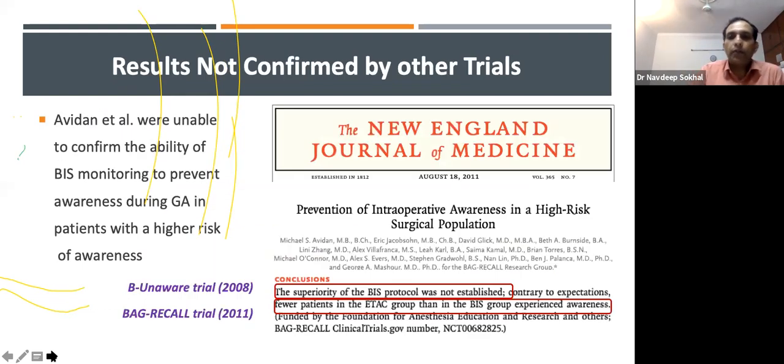But then there was another trial published in 2008, the B-Unaware, and the BAG-RECALL trial in 2011, which did not show this superiority of the BIS protocol. The superiority of the BIS protocol was not established. In fact, they said fewer patients in the ETAC group, that is the end-tidal anesthetic concentration group, where you monitor end-tidal gas anesthetic concentration or MAC during inhalation anesthesia, experienced awareness than in the BIS group. So it was rather a negative study.